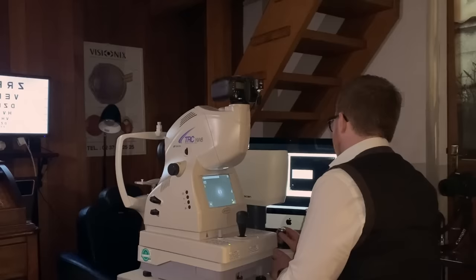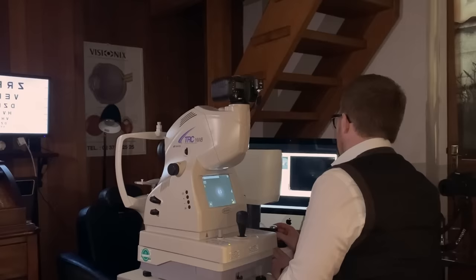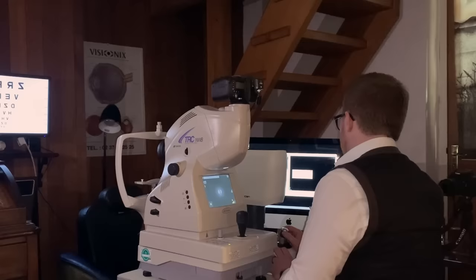And then still with this eye, what we're going to do is I'm going to move that little light and it should go over to your left now. So still looking at that little light there over to your left. Lovely. And we're going to do exactly the same with your other eye.